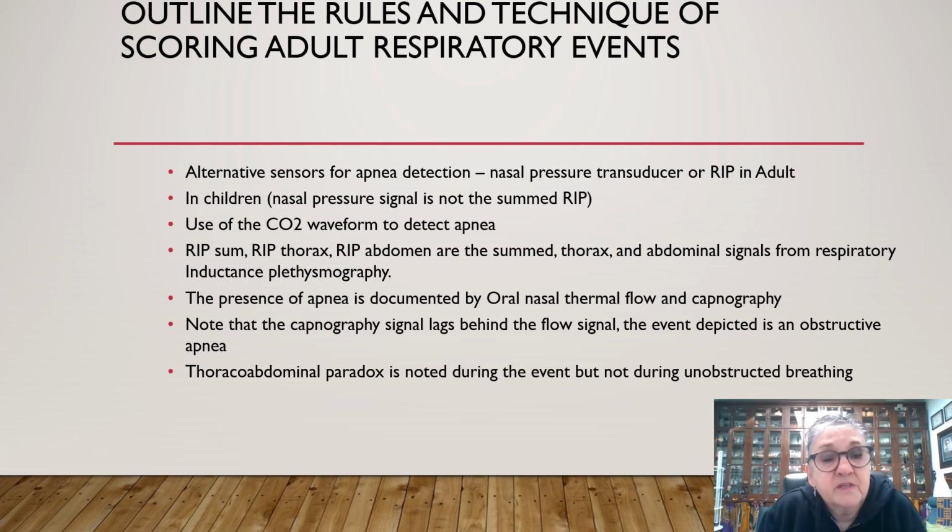The presence of apnea is documented by the oral nasal thermoflow and capnography, and note that the capnography signal lags behind the flow signal, and the event depicted is obstructive apnea. Thoracoabdominal paradox is noted during the event, but not during the unobstructed breathing.